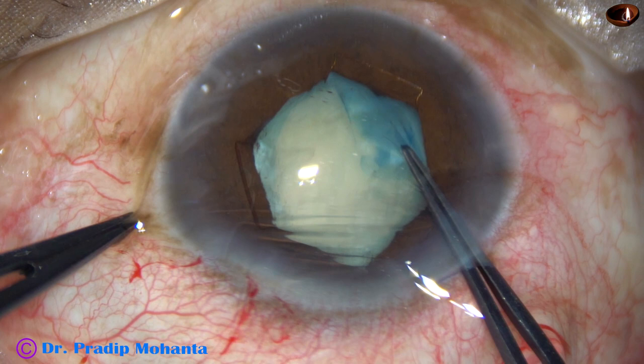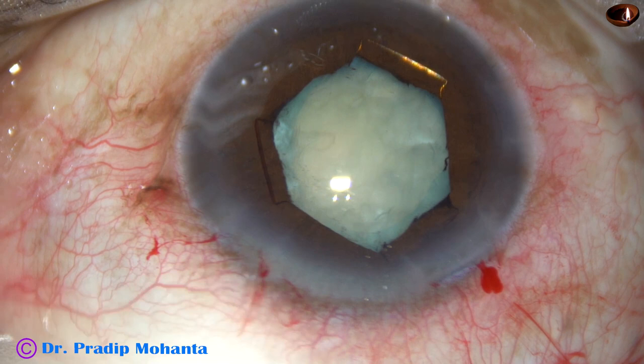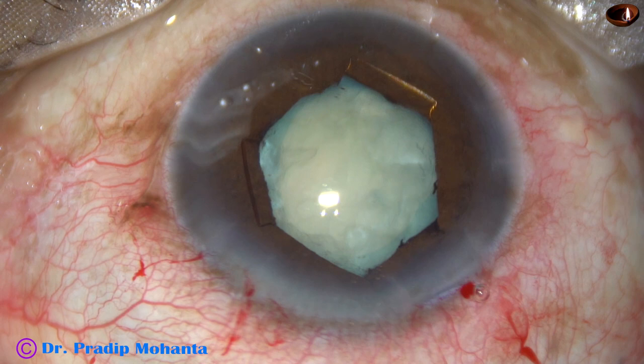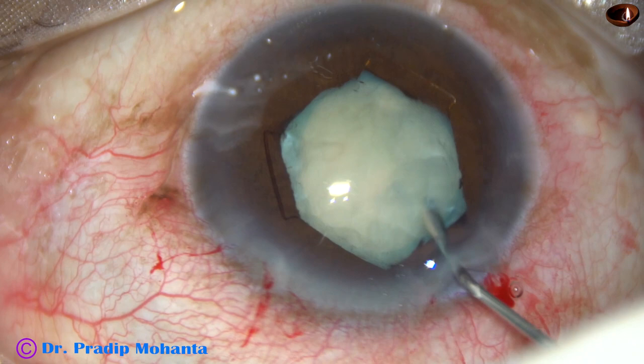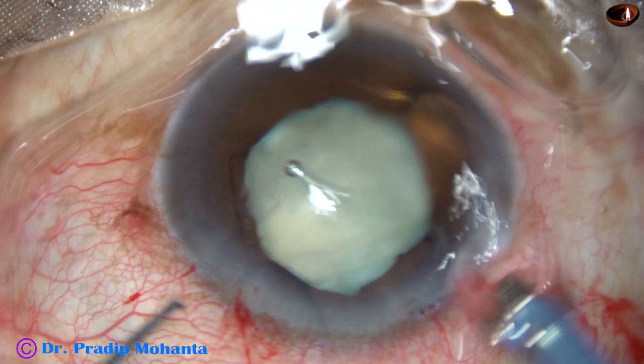Visco is injected again and the phaco handpiece is introduced. Before that, the nucleus is mobilized. The machine being used is Oertly Catarix 3. The easy tip is introduced, cavitation is performed, and some cortical matter is removed.